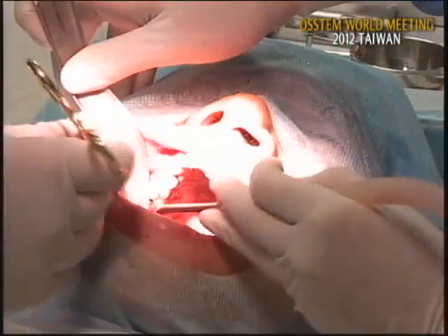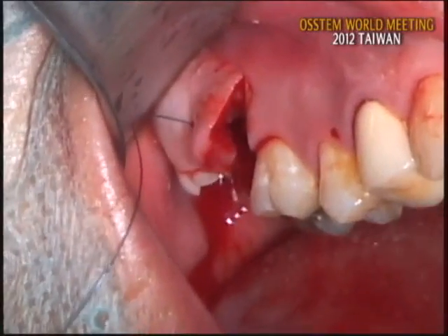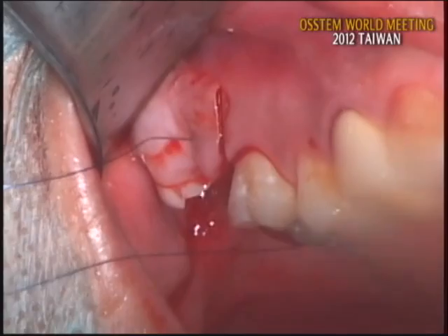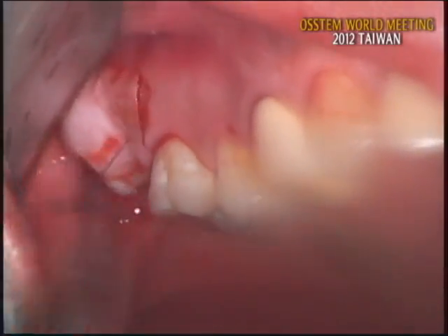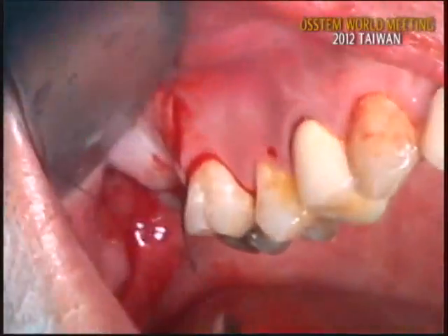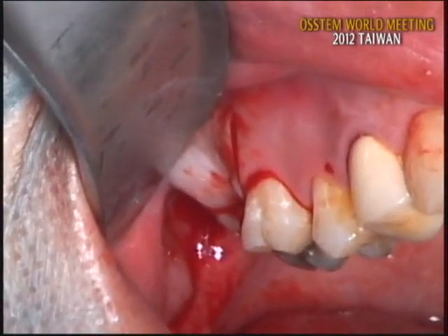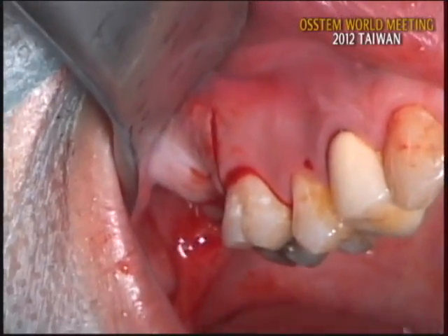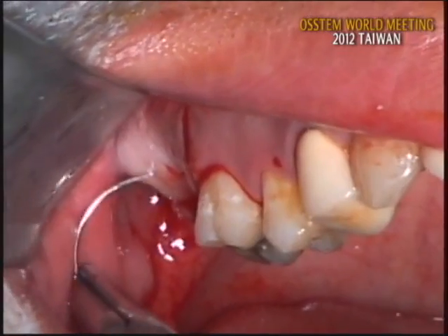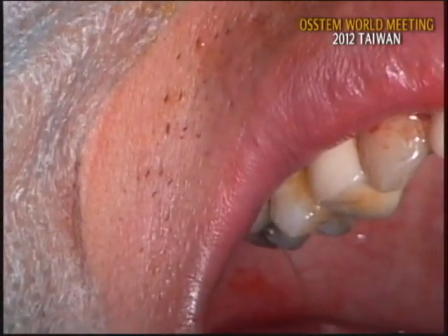You see that the CAS-KIT is very safe and straightforward. I always feel very comfortable using the CAS-KIT because I can avoid malleting, and it is very safe and very speedy to penetrate the sinus floor. And the hydro lifting system is also a very nice device to detach the membrane. With just an osteotome, we cannot detach the membrane as we want, but with the CAS drill and the hydro lifting system, we can sufficiently separate the membrane. That makes a broader and wider contact of the grafted material, which facilitates new bone formation.